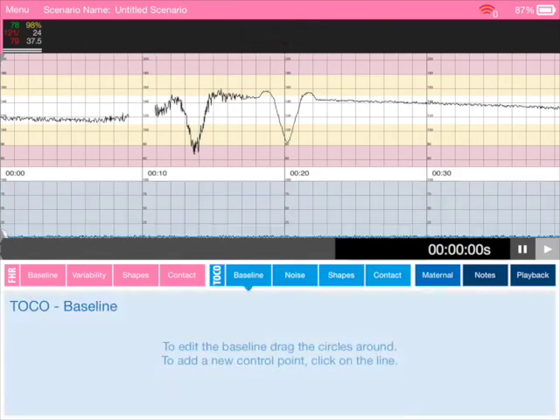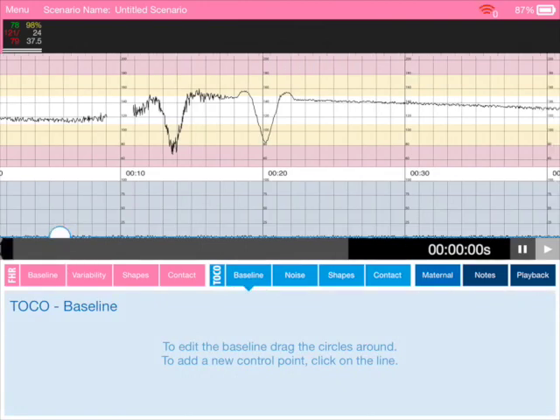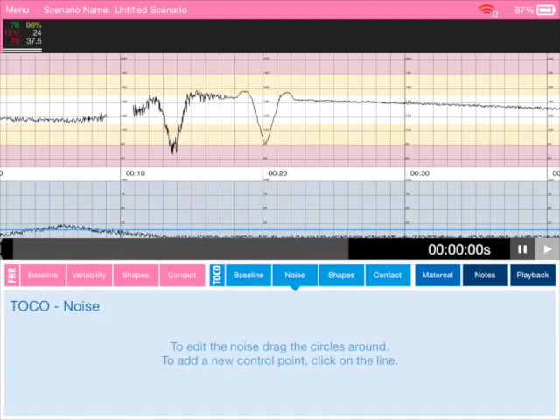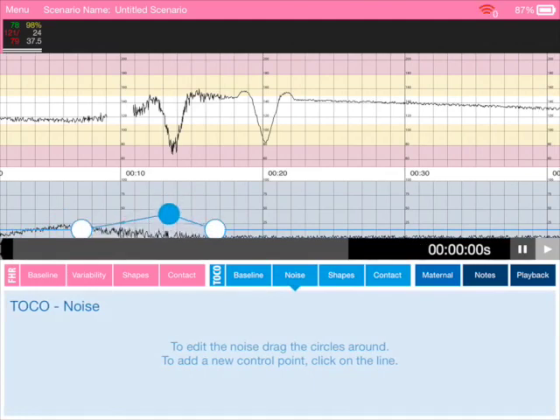Same controls for the tocograph. There's the baseline controls there. You can see we can move those around. We can add some noise to this to make that sort of appearance there.